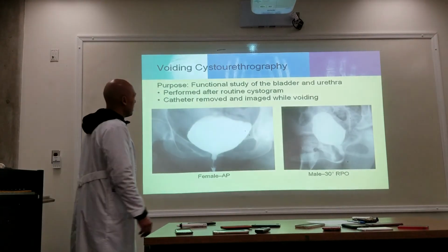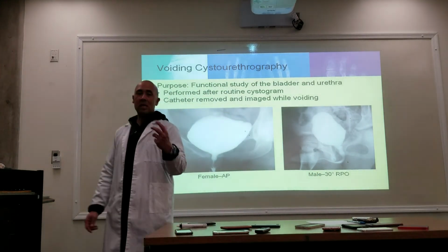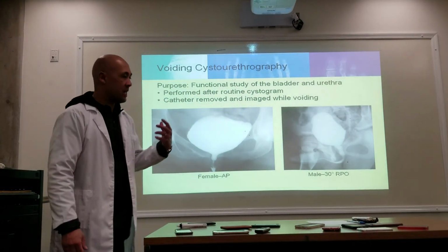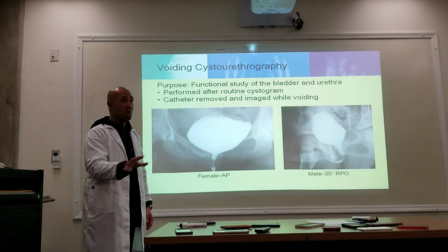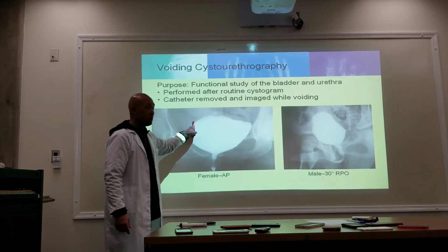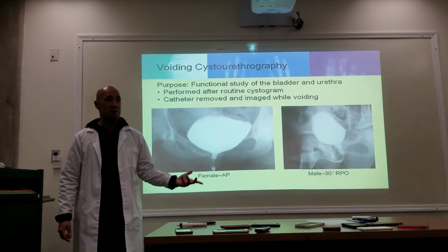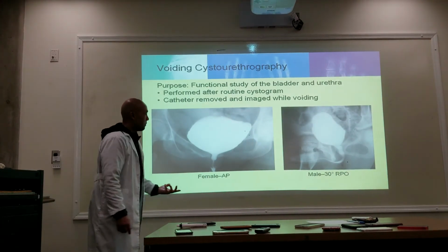Now, if it's a voiding cystogram, the process is the same. We instill the contrast via a catheter using gravity. Again, cystogram is non-functional. Voiding cystogram is functional because now we're going to have our patients pee.